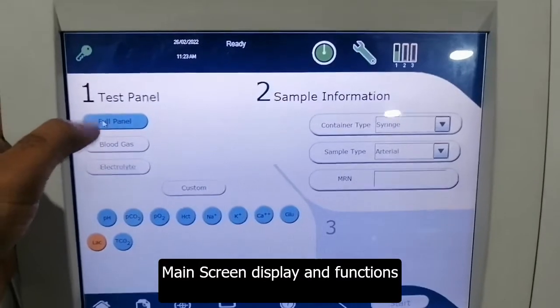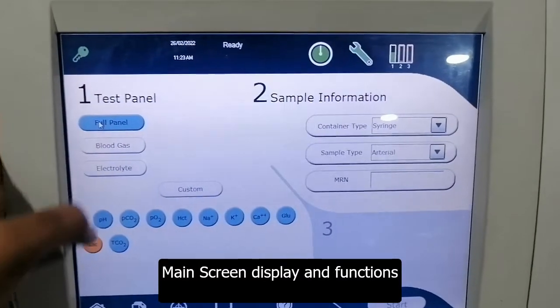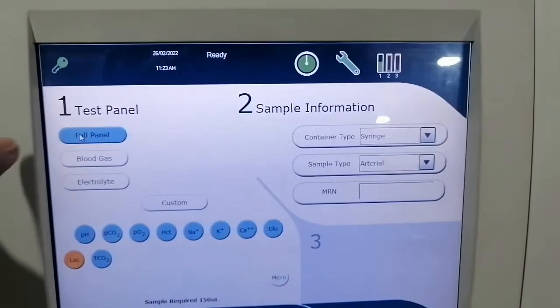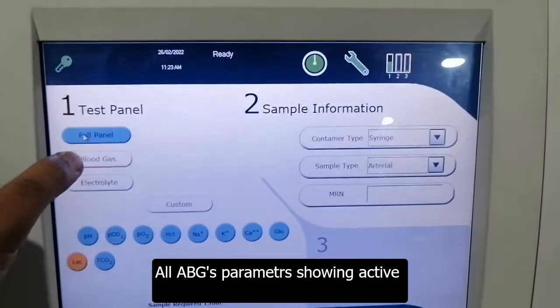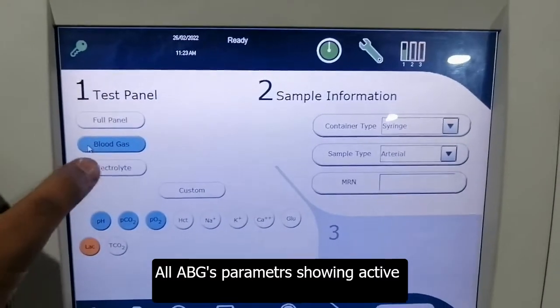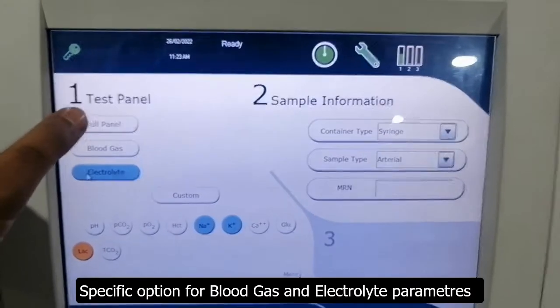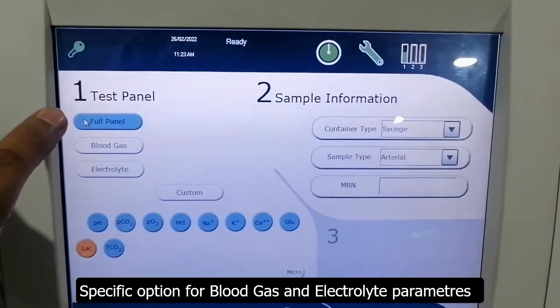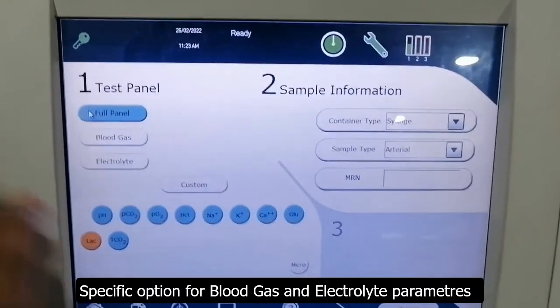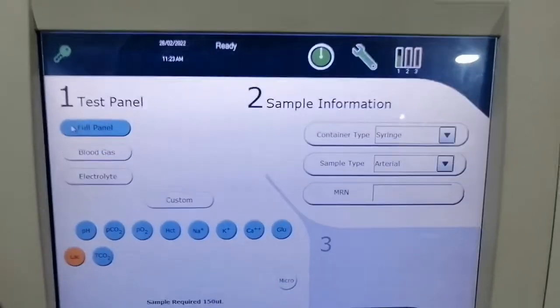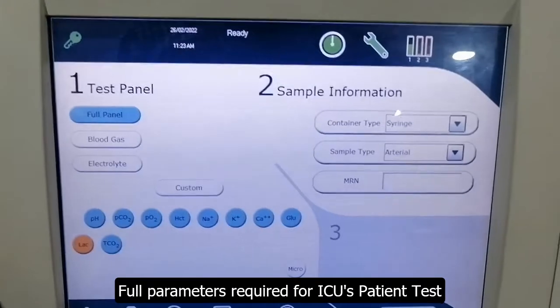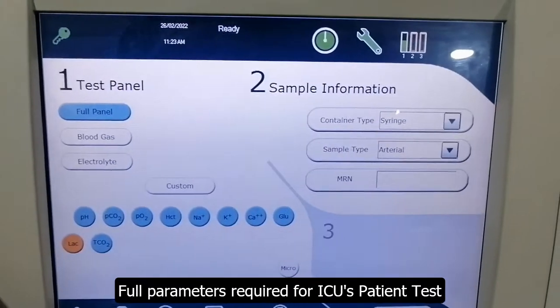This is the main screen — the full panel view where all parameters are shown below. These are the blood gas parameters and these are the electrolyte parameters, so we can run the full parameter set for our ICU patients. This is the home screen.